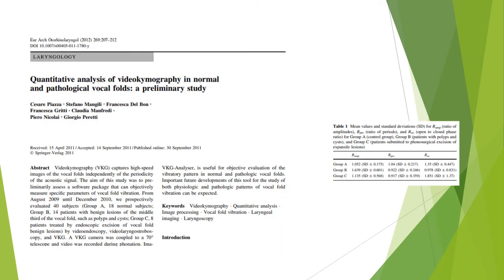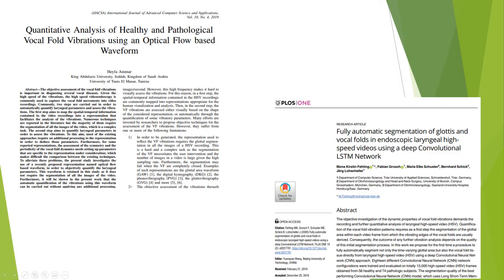Out of the 11 papers in the Cochrane Library for quantitative vocal fold analysis in randomized controlled trials, only one included relevant quantitative measurements. The reason why new methods are presented in the literature is of course that the techniques for now are not sensitive enough to pathological phonation.